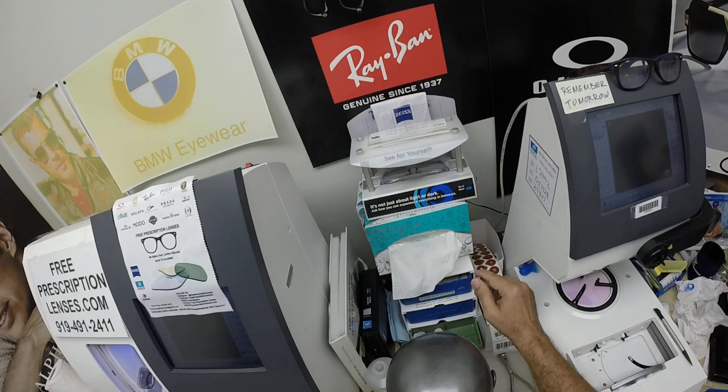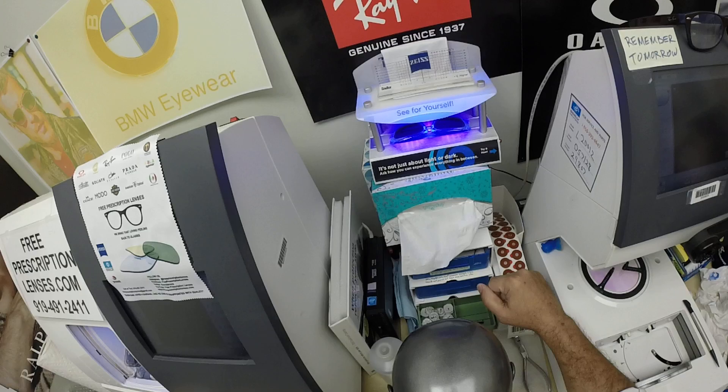Let me show you what these look like. That's what they look like clear indoors. Now let me show you what they will look like when you go outside. It takes about 30 to 45 seconds for the lenses to darken.